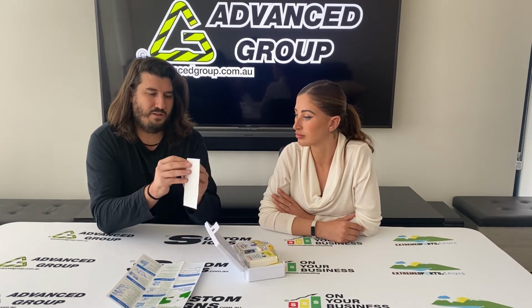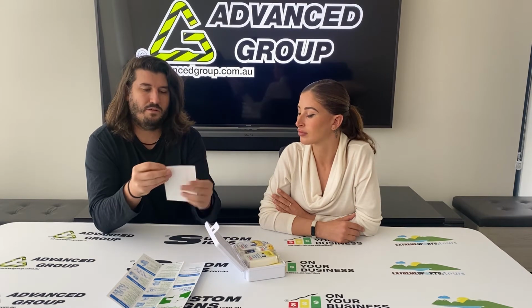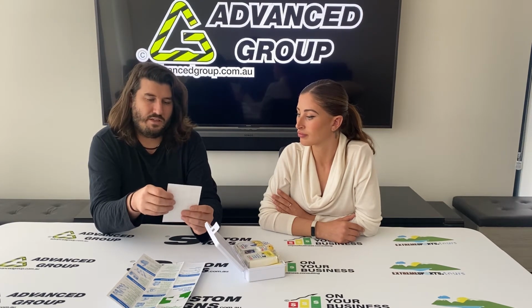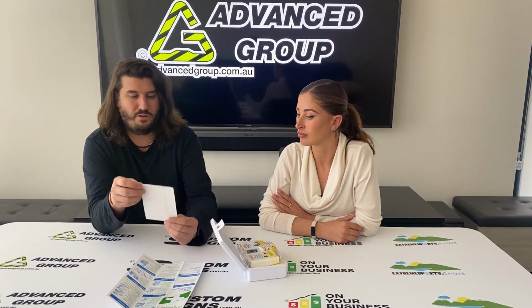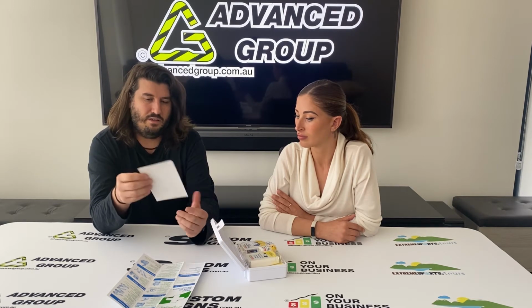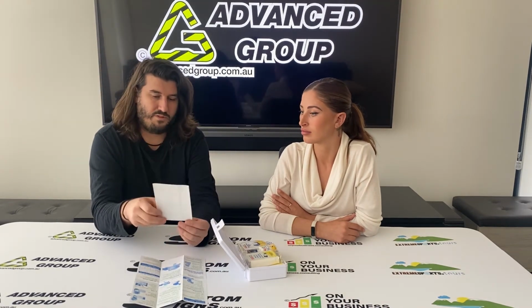Another thing on resuscitation. Now, this looks like it's a sticker. Just confirm that. Yes, it is a sticker. So if you wanted to, you could put this in the cupboard where you might keep this, or stick it on the actual case or something. Just don't put it over the use by date. You can put it wherever you want, or just keep it like that. It's up to you. The CPR stuff is also on this pamphlet, so it's just a supplementary thing.